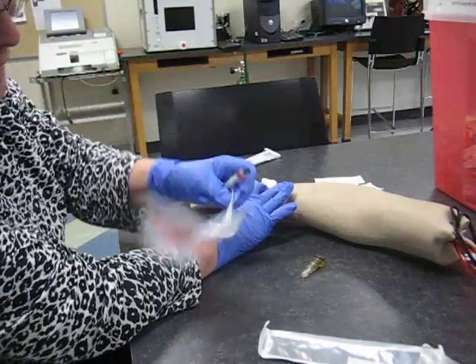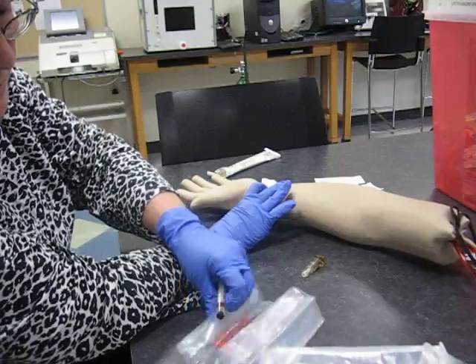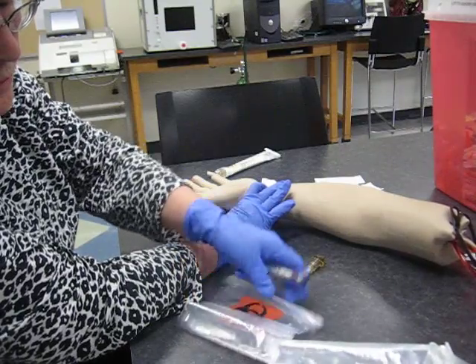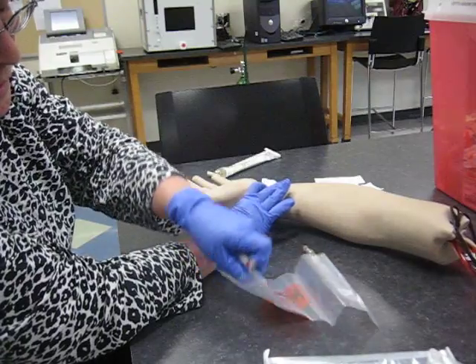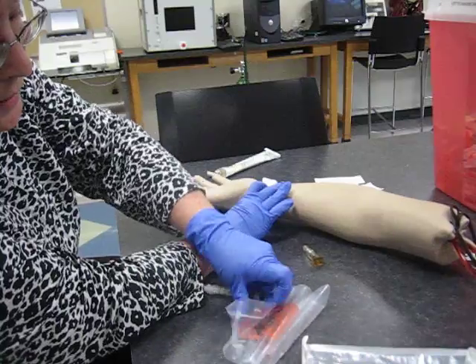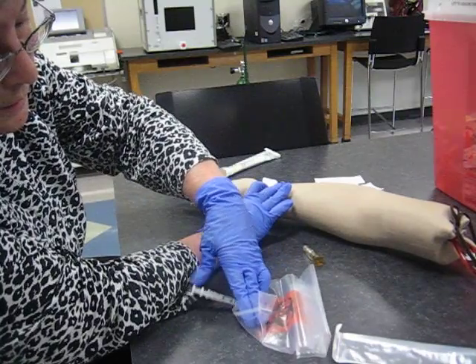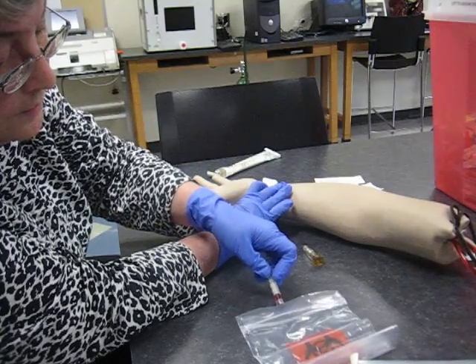I put it in my bag, which I have already labeled with his name and number, which I checked against his name badge so I know it's really him. I've already written his information — his two-liter cannula and his sat — at the top of the gas.